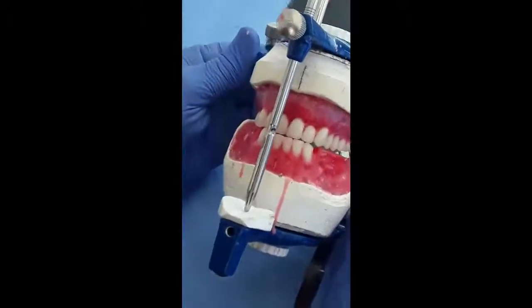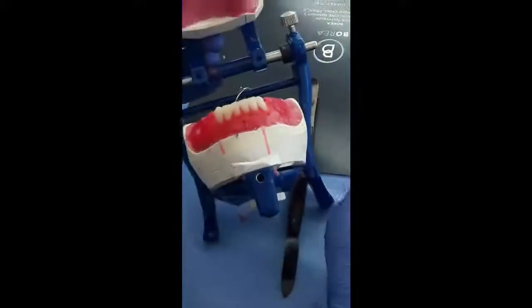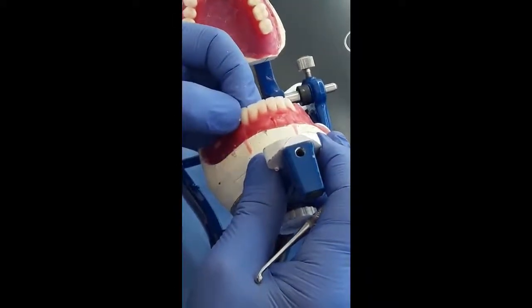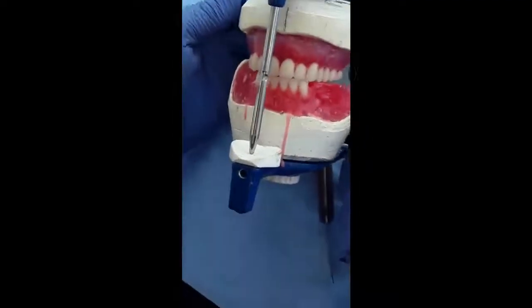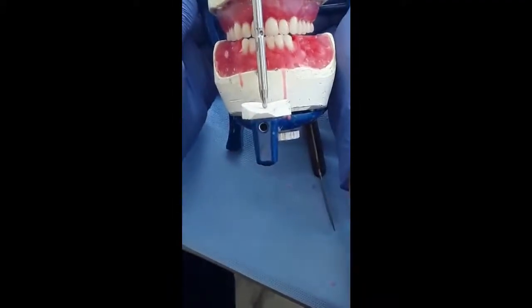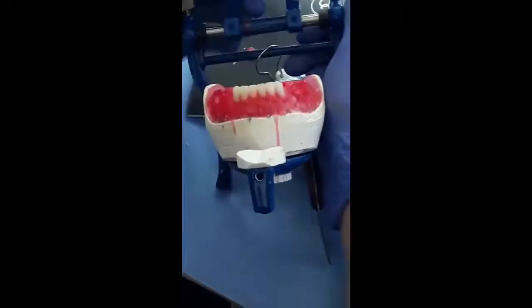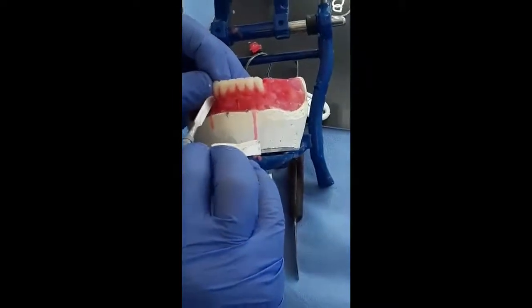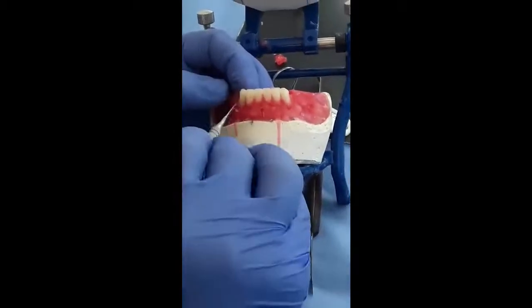Now if I move here, I notice that the canine is raising, so I need to decrease the amount of overbite by pressing it and reduce the amount of overbite. Now the canine here is no longer interfering with the occlusive movement, and I can see that I still have a chance to raise it a little bit so I can achieve tip-to-tip touch with the maxillary canine in the lateral excursion.